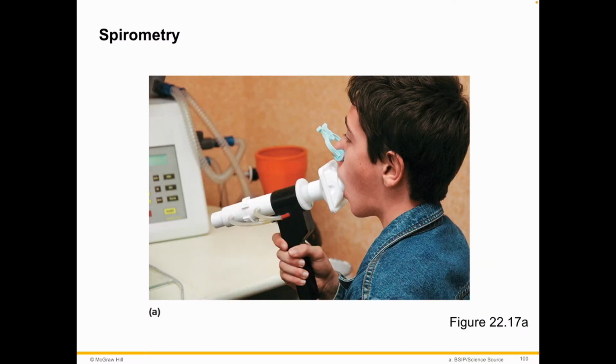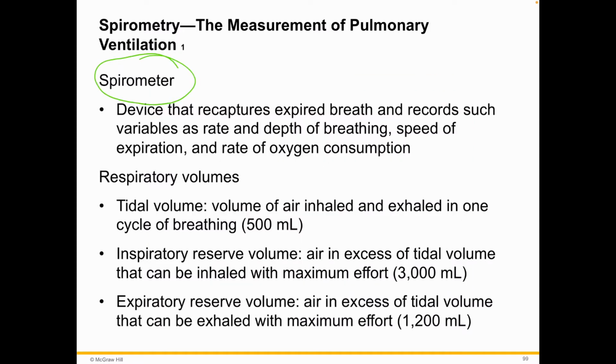So, let me see if I can just show you the picture. Here's one of many different kinds, right? So basically, you're going to blow in and you're going to push out, right? And it's going to measure the volume, how much you're blowing in and blowing out, right? So that's it. And they don't all look like that. They're very, very simple, actually.